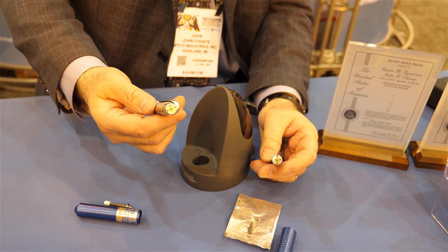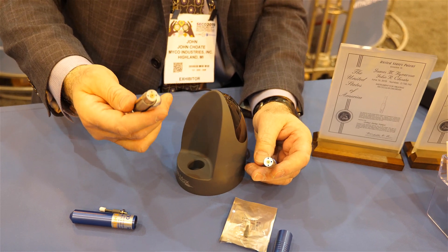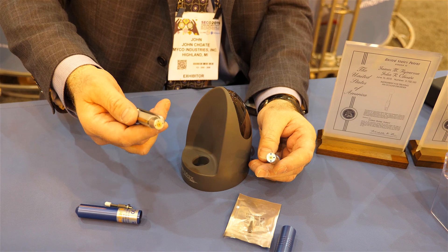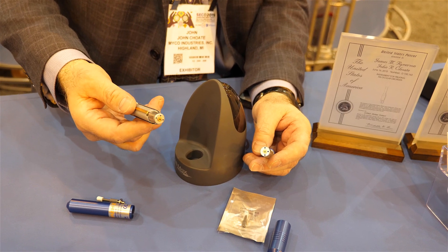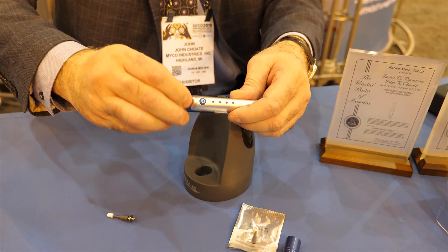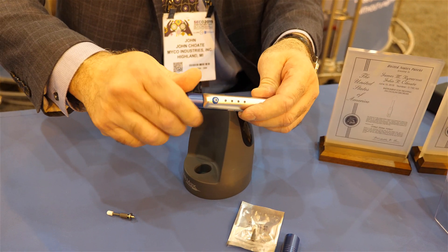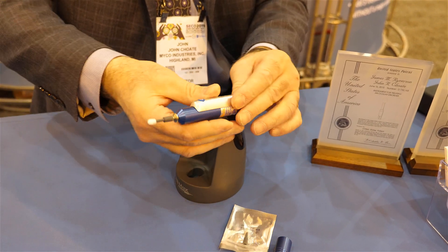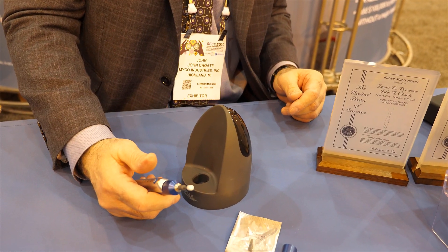I've been working for a couple of years on designing the AB Max to enhance that procedure and enhance the ability for doctors to treat anterior blepharitis. Specifically, we filed patents on our pulse mode, which essentially oscillates the tip. Once on the patient's anterior eyelid margins, it actually gently massages the eyelids.